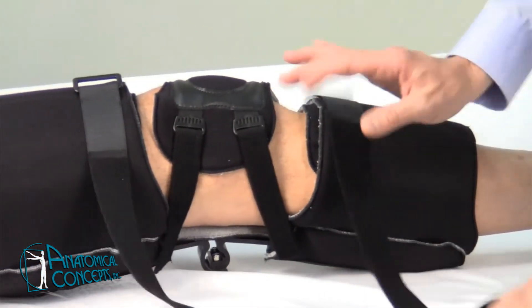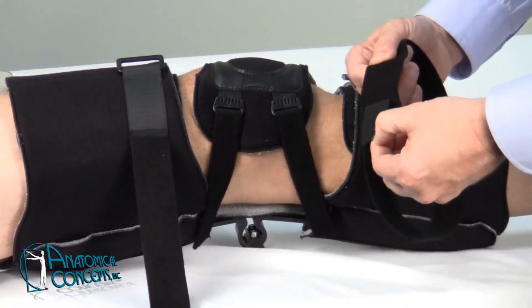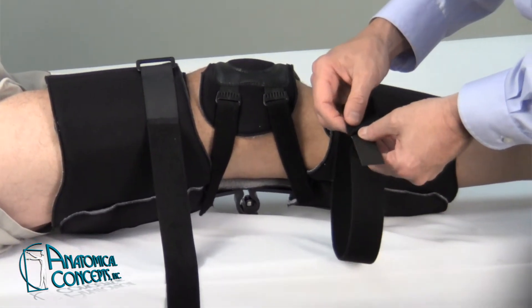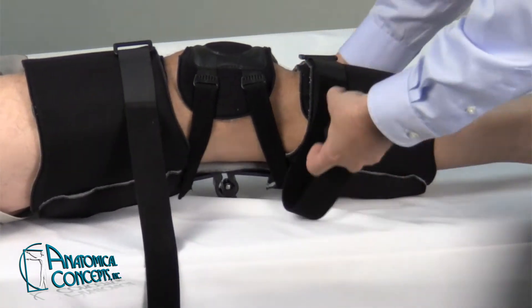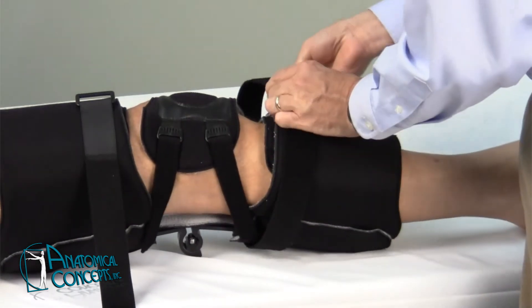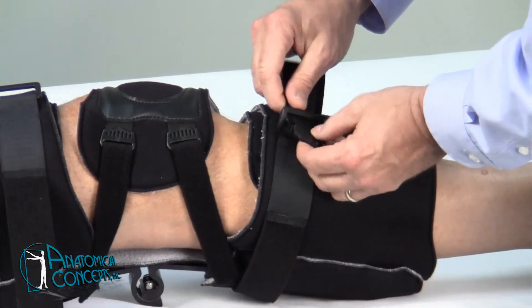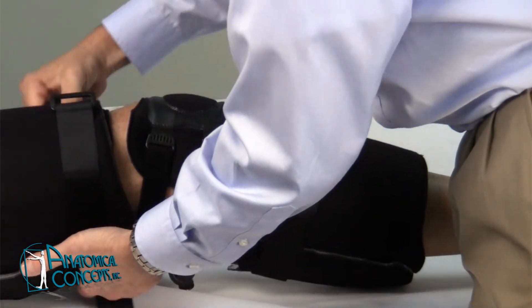You can do the same on the calf section — it simply wraps around the extremity. You have the ability to cut off or adjust the length of the strap by pulling this tab off, cutting the strap down to the appropriate length, putting this back on, and closing that back over. You would just wrap this around the patient's leg and fasten it through the buckle, then fasten that back onto itself. The same applies on the thigh section.